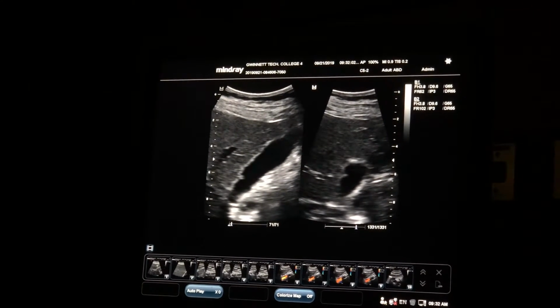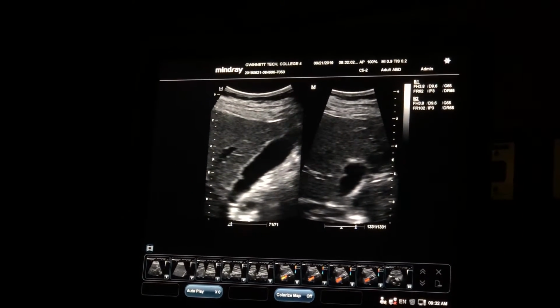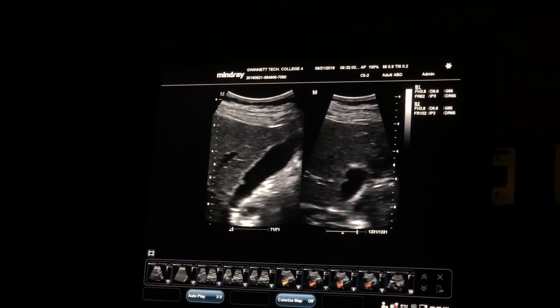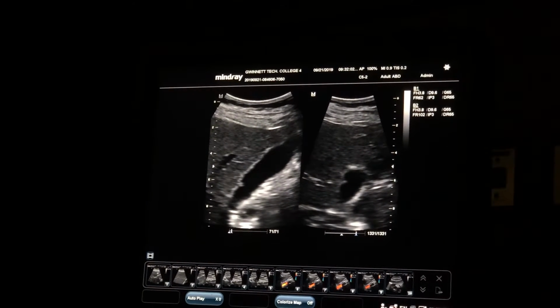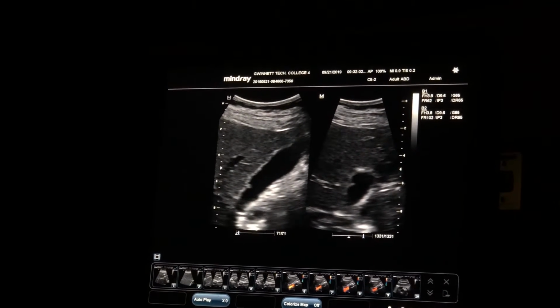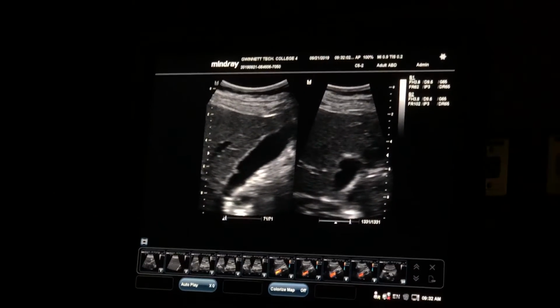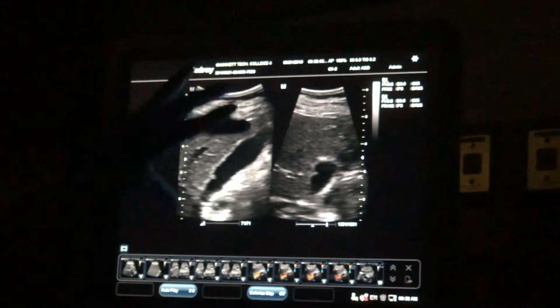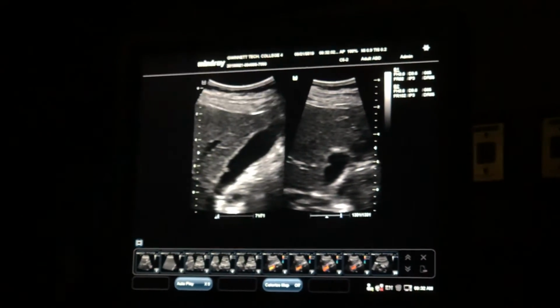Those gains are gonna matter when you're scanning a difficult patient. Maybe when you're scanning a perfect, easy patient, that's fine. You don't have to try as hard, but that's why we need you to be trying hard here. And we need you to be turning those knobs and using those buttons, because if you don't practice now, you're not gonna do it later. And you want to make sure that you're always trying to be optimizing your image. I could have even narrowed my sector here if I couldn't see it well, or I wanted to clear out my image, I can still narrow my sector in long.